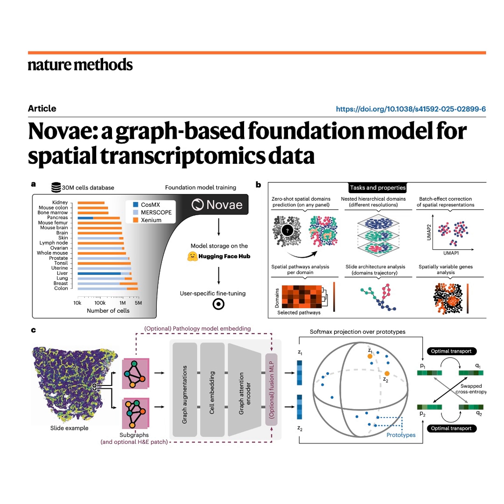Shifting to cancer, Novae also showed its flexibility by analyzing spatial protein data from CosMx in head and neck cancer. What did it find regarding that favorable prognosis biomarker, the multinucleated giant cells, or MGCs? Novae found that MGC-positive patients, so those with a better clinical outcome, had a significant reduction in a specific stromal-like domain, D497. And why does that matter?